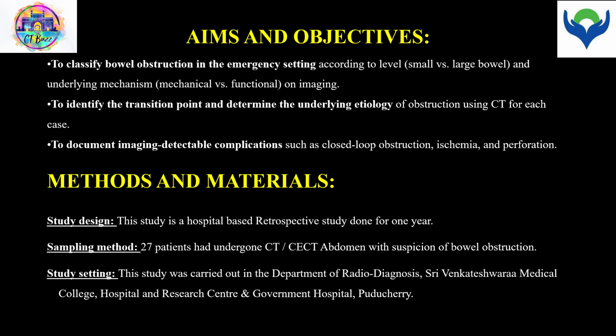Methods and materials. Study design. This study is a hospital-based retrospective study done for 1 year. Sampling method is 27 patients who had undergone plain CT or contrast enhanced CT with suspicion of bowel obstruction. Study setting. This study was carried out in the Department of Radiodiagnosis at Sri Venkateshwara Medical College Hospital and Research Center and at Government Hospital Puducherry during DRP postings.